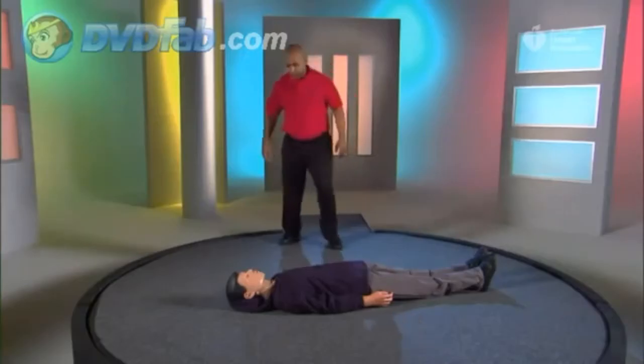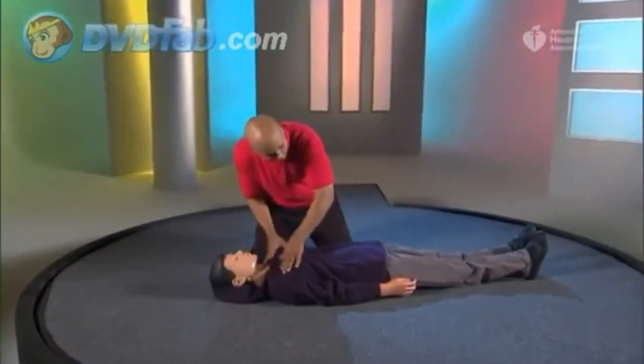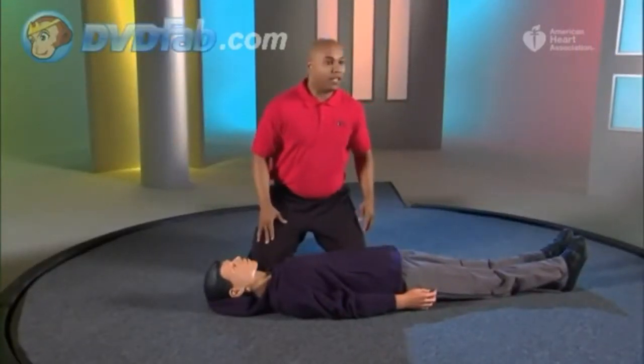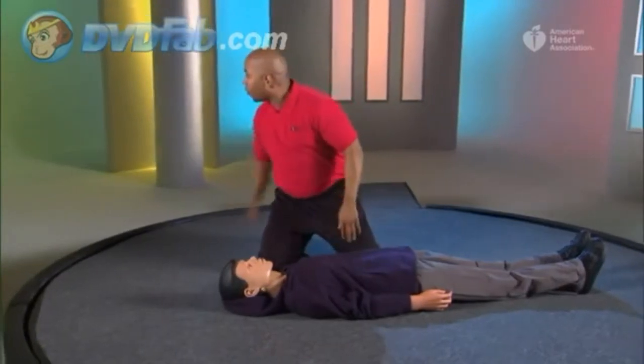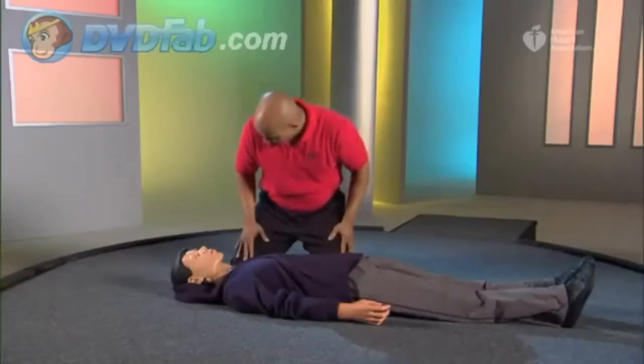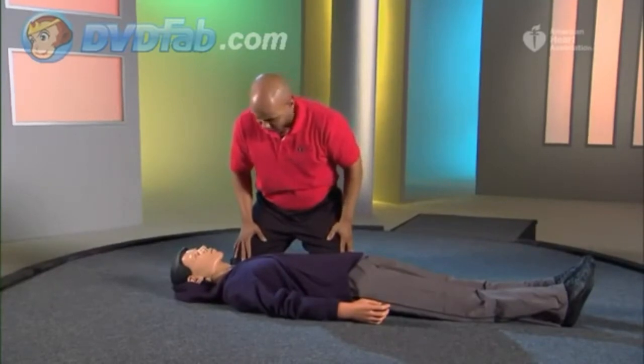Make sure the person is lying on their back on a firm flat surface. Tap and shout to see if the person responds: "Sir, are you okay?" If not, yell for help. Send someone to call the emergency response number and get an AED. Then check for breathing for at least five seconds but no more than ten seconds.